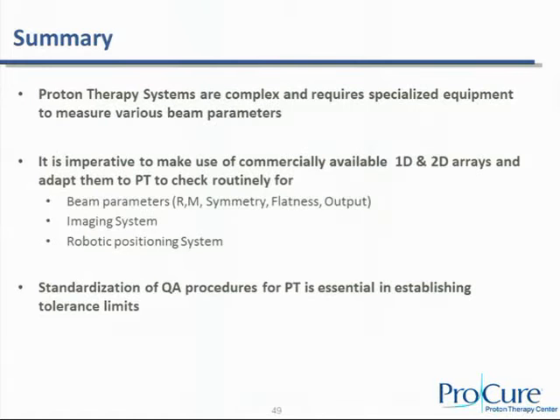You also have to understand your imaging system and characterize it. You heavily rely on imaging because you image for every beam, so those X-rays and detectors are worked pretty hard every day. You also need a check for your robotic positioning system. It's a highly accurate device.